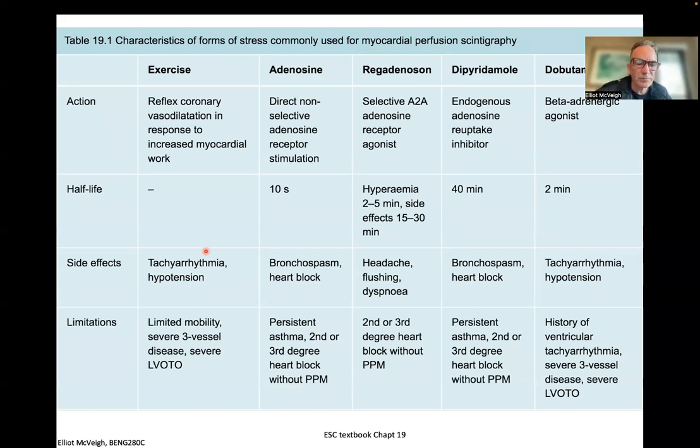They're going to be done. However, it's a really good way of doing stress. Then there's 4 drugs. Adenosine, widely available, not expensive, right? It basically, when you inject it into a patient, opens up their vascular bed, right? So all of their vessels dilate. All of the vessels that control dilation dilate. And then without doing any exercise, all of a sudden the myocardial blood flow, if you're normal, jumps up, right? And so you look at that in a patient for regions in which it doesn't jump up.